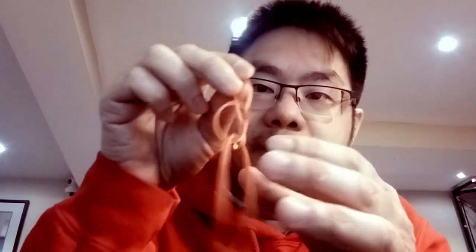And then what we're going to do is take the end of this side of the elastic and loop it through, and stick it inside this part of the elastic. And then you just pull it through and it creates a nice little loop there, and now you've got 2 elastics attached together. You can keep repeating that process to get enough elastics until you hit the comfortable point. Hooks at the end, the elastic just goes into the hook.